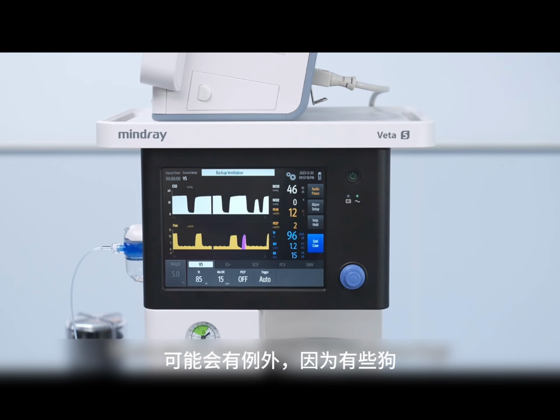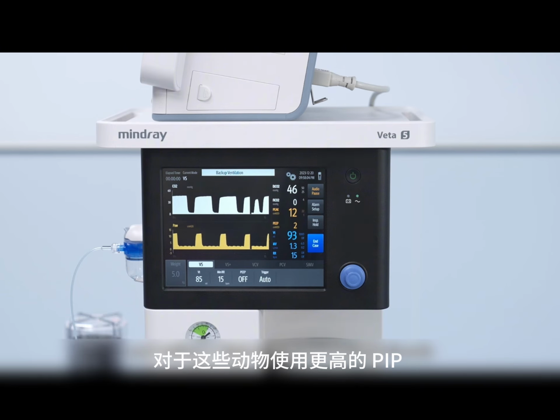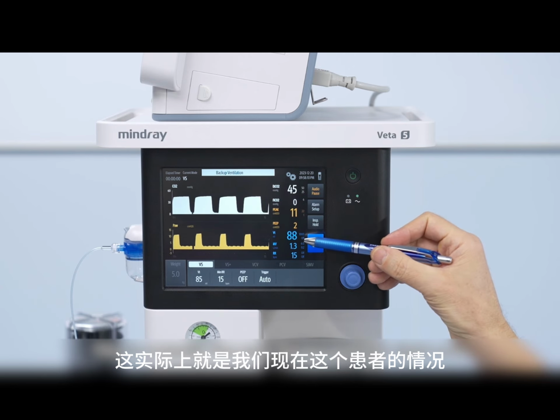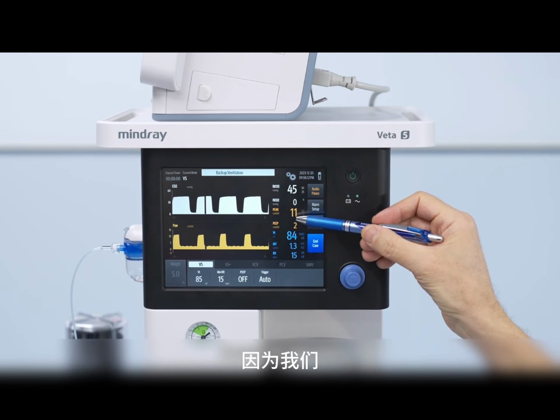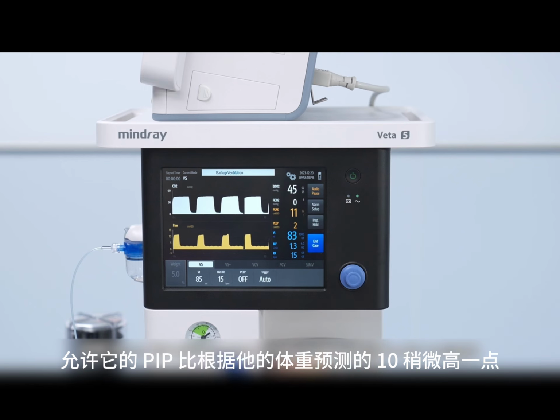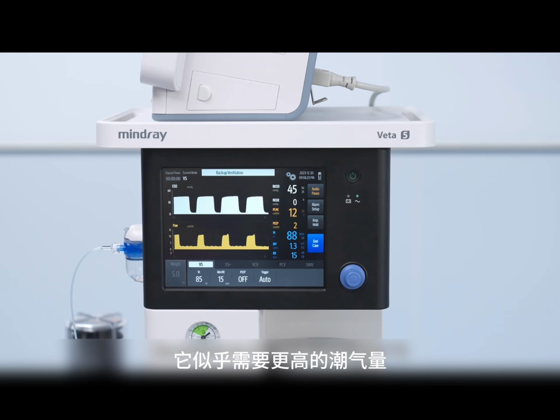There can be exceptions because some dogs may have low chest compliance, and using a higher PIP for these animals may be necessary. This is actually the case for our patient right now, because we are allowing him to have a little bit higher PIP than 10, which was predicted by his body weight. He seems to be needing a higher tidal volume.